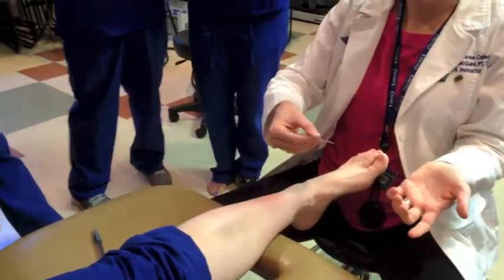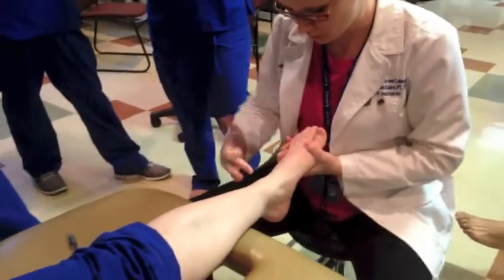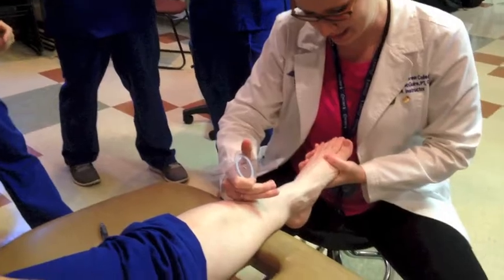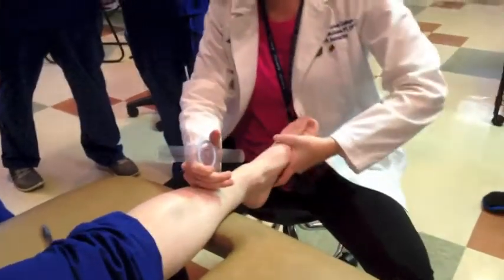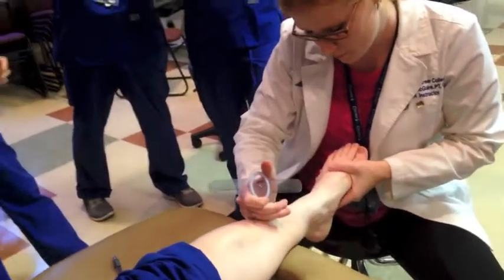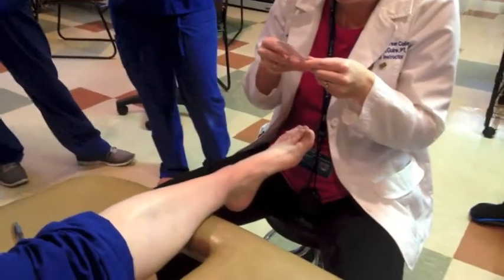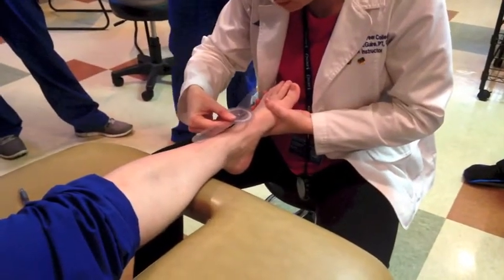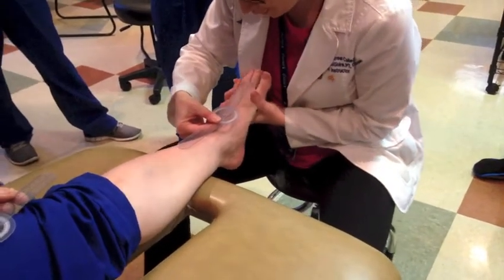Now we're going to do eversion, which means we're just going to go the other way from zero. Let's take a look first — most people have a little less eversion. You're definitely locked back here. That looks maybe 20 degrees, maybe. Let's take a look and line this up. I always do fulcrum first, then my stationary arm, and then I'm going to move her.